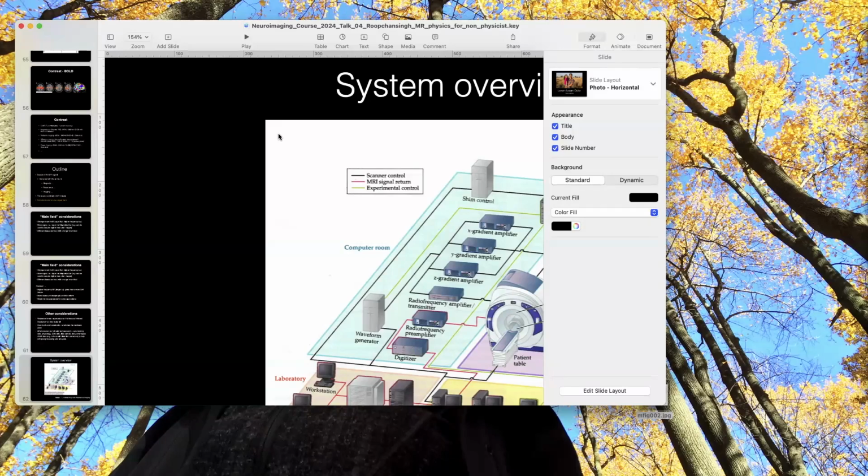These are not, in the traditional sense of the word, noise, because they still get encoded into the signal and we detect them, but they're modulating our signal in ways that we're not controlling and usually not accounting for, unless we collect some of this additional information that I mentioned at the end, that we can maybe use to correct for those effects. So does that maybe get it? Yeah.